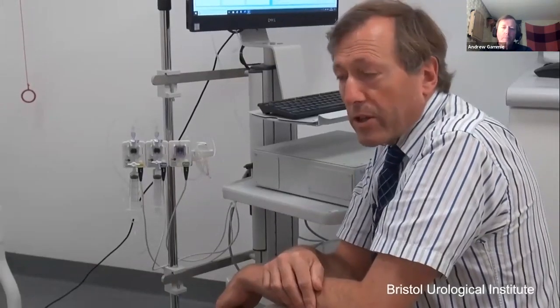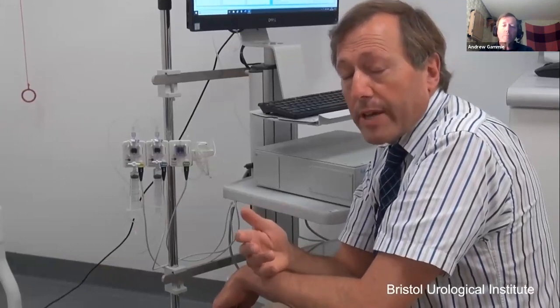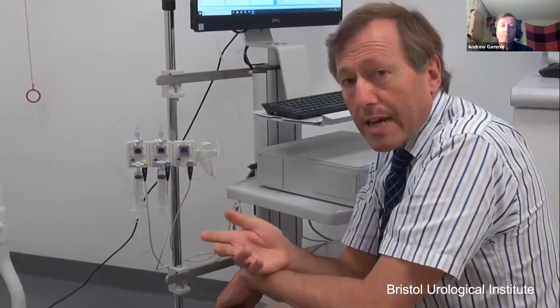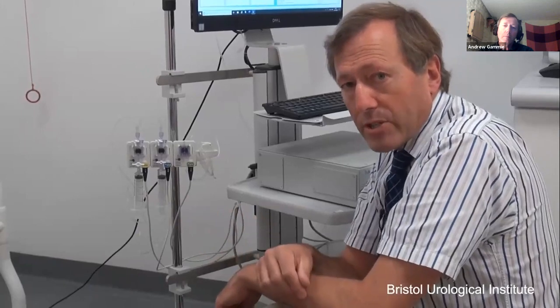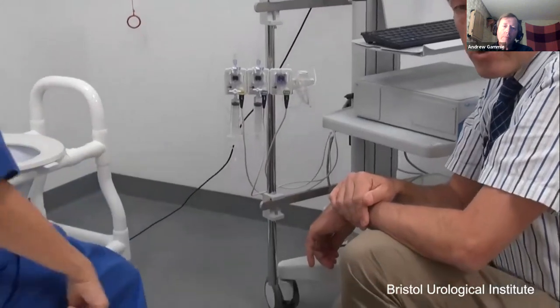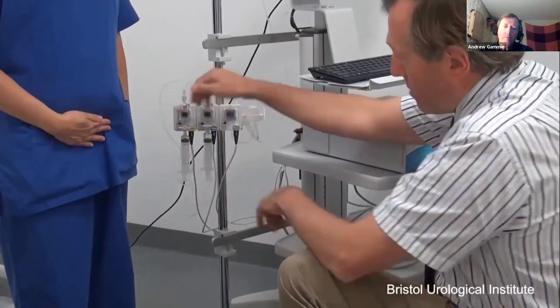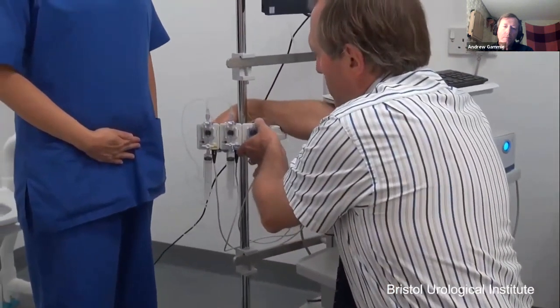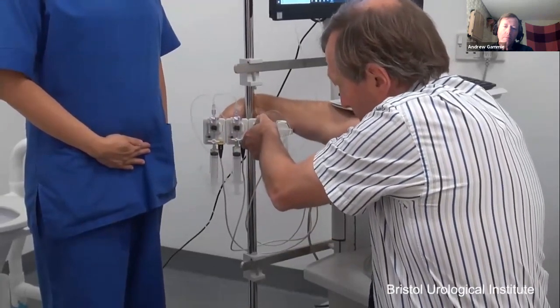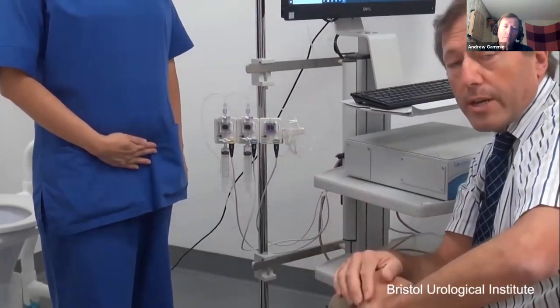So once we've checked the catheters are in place and they're all functioning correctly, we'll be asking the patient, in the case of a man, to stand up for the filling phase. Or for the woman, we might have her standing up in order to do some stress tests. So when your patient is standing up, you want to make sure that you get the level of the symphysis pubis correct. Now it is up here, so I need to change the level of my transducers so that the whole of the outlet is level again with the symphysis pubis. And now we can carry out the stress tests.